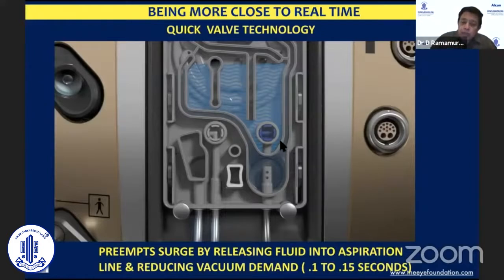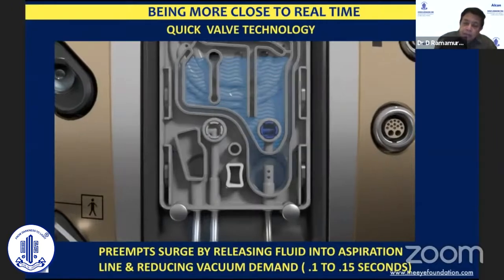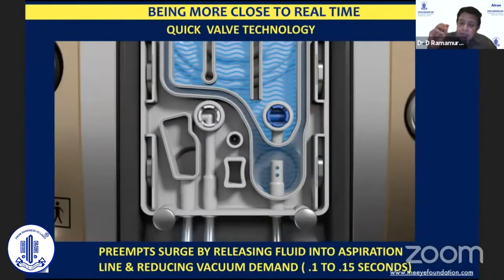Essentially, what the quick valve technology does is to cause a slight movement of this valve so that a certain amount of fluid is injected into the aspiration tubing. So the vacuum level that builds up in the aspiration tubing is mitigated, and thus the fluid that's sucked out of the anterior chamber is somewhat lessened. It is not a large amount of fluid that is moving inside, which would result in a loss of contact or loss of the nucleus piece being sucked onto the phaco needle, but just enough amount of fluid going into the aspiration tubing so that fluid is not aspirated from the anterior chamber, but the vacuum that is built up in the tubing is compensated by the fluid which is stored in the FMS package as such.